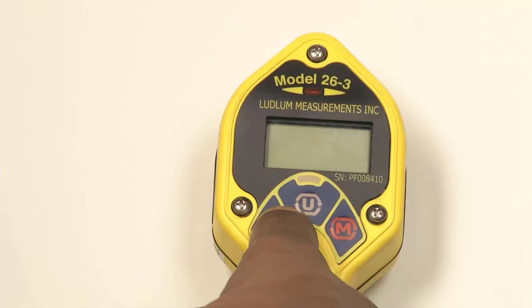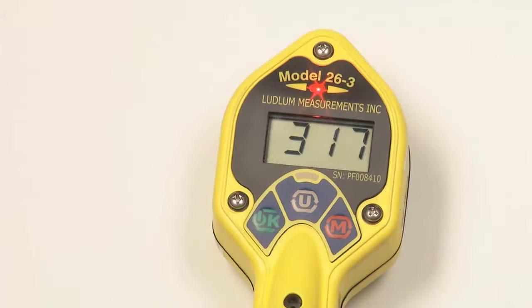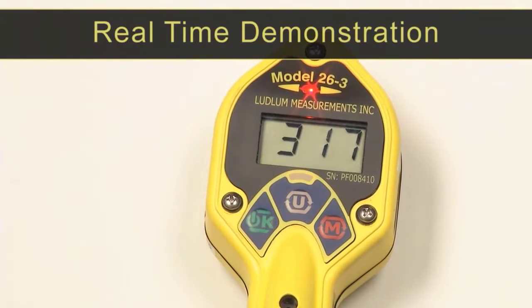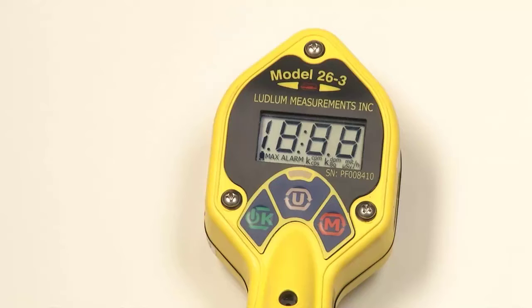Turn the instrument on by pressing the OK button for about a second and then releasing. The instrument should activate all the LCD segments, display the firmware version number, and briefly activate the LED alarm. The instrument will then begin normal operation, displaying the default rate in CPM. Units can be changed by pressing the U button. Observe the device during this time — if any LCD segments are missing or audio fails to work, the device needs to be repaired and should not be used.